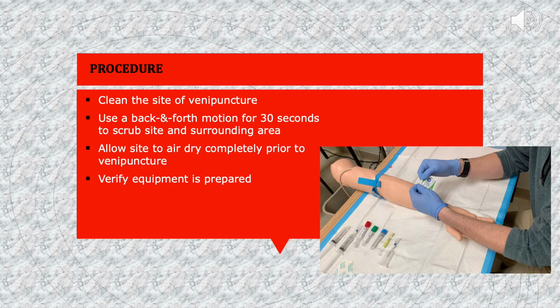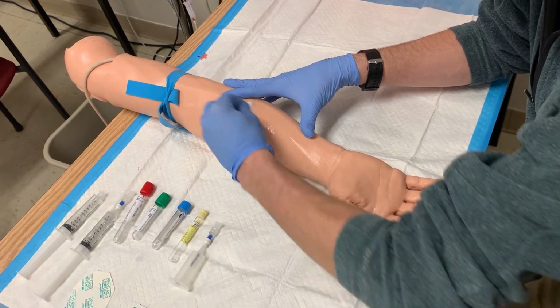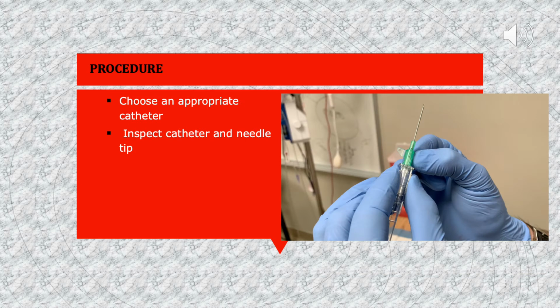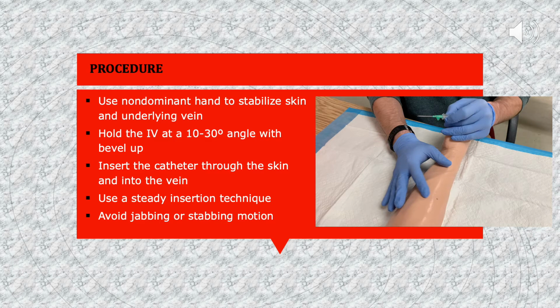Clean the area to be used, as shown, for a minimum of 30 seconds using a back and forth scrubbing motion. Allow the site to air dry completely before insertion of the catheter. Follow local hospital protocols. Remove the catheter assembly from its sterile packaging and inspect the needle tip for any burrs or irregularities. Use the non-dominant hand to pull the skin taut below the entry site. This stabilizes the vein and can also make initial tissue penetration less painful.